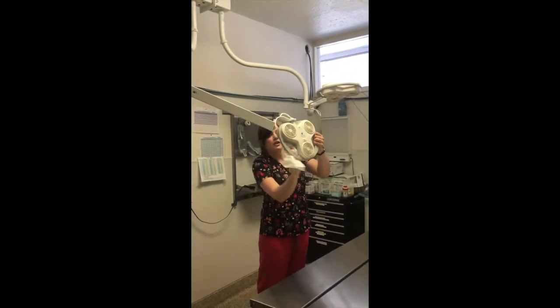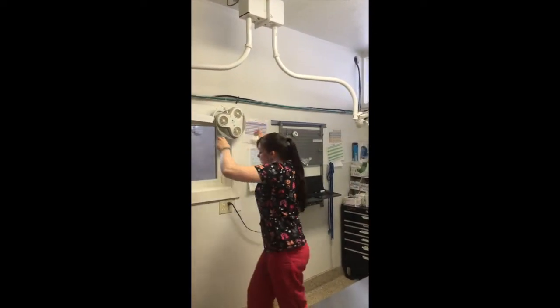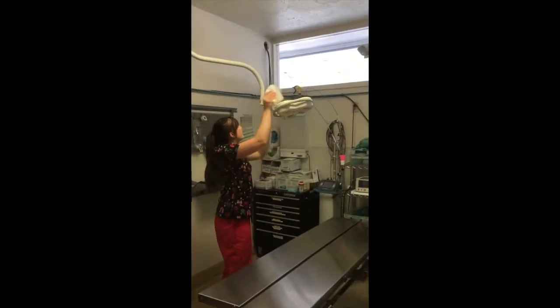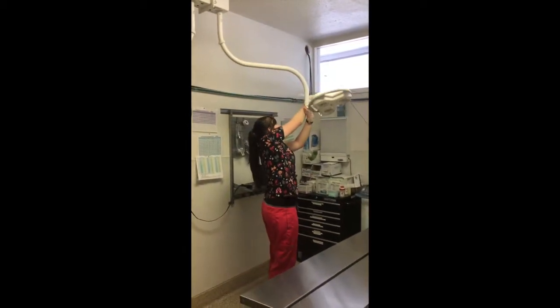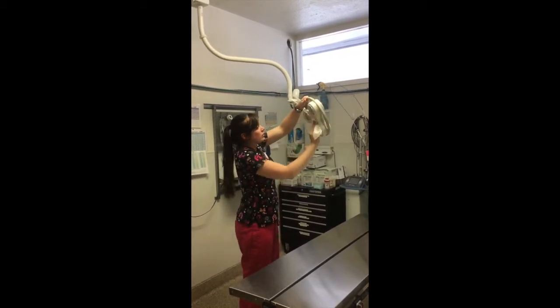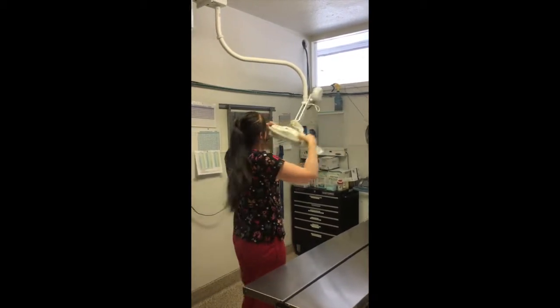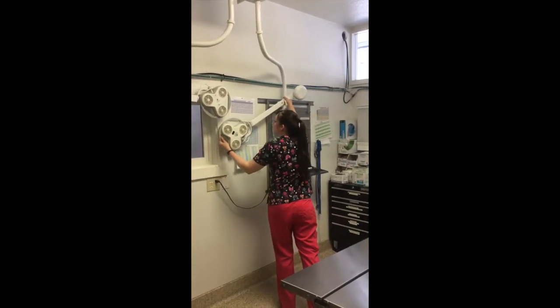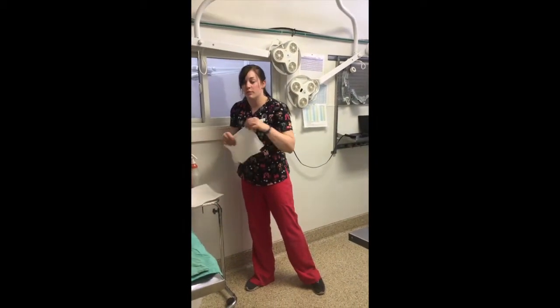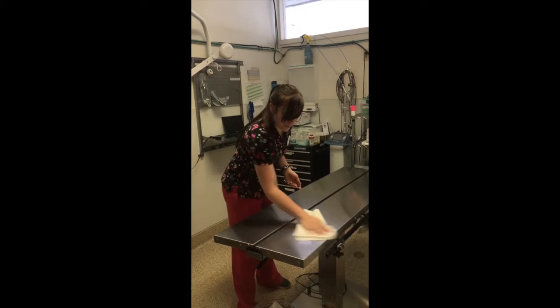Okay, then wipe down the underside. And we're going to put this one back up against the wall so it's out of the way. Some more spray. Surgery table. So we're going to put some more spray. You're just going to wipe down your surgery table.